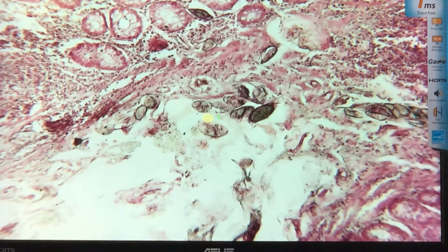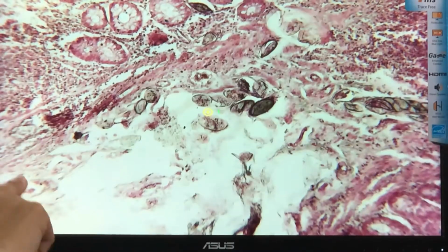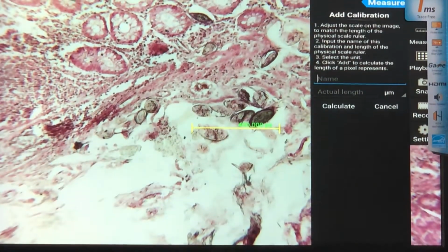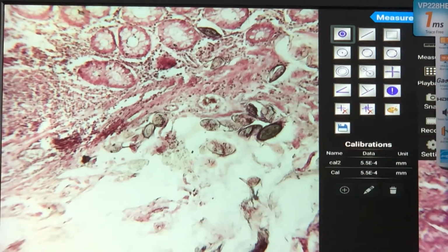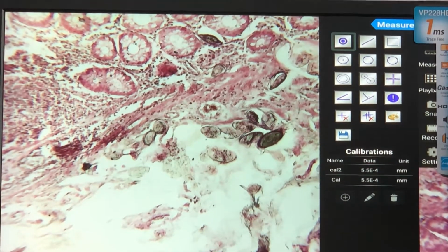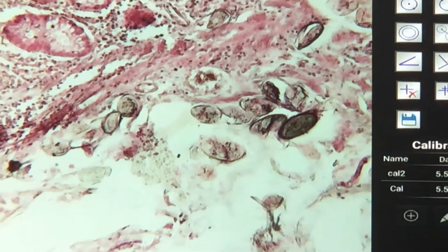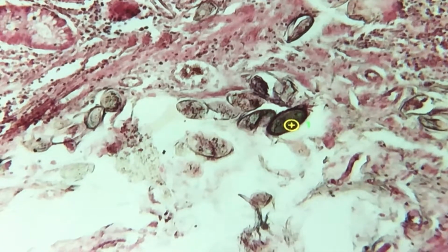Nobody would ever mistake this diagnosis, especially when you see this in the practical exam. If you still make a mistake there, maybe it's time for you to cry. Nobody can make mistakes on this. I haven't seen any student make a mistake except in reading the side question, because sometimes the side question does not ask you for the diagnosis. This is the one where I will let you identify the structure at the tip of pointer 1.